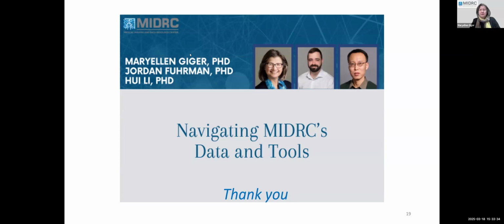Yeah, I also note that when you go to midrc.org and you look at these tools, often we have published work on the tools, and those are all there. They're in the resource page that we showed you, as well as the GitHub page. If there's an associated MIDRC publication, you'll find that there also. And then our GitHub is public.